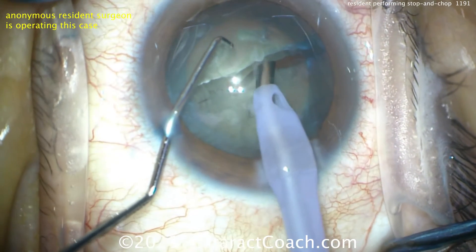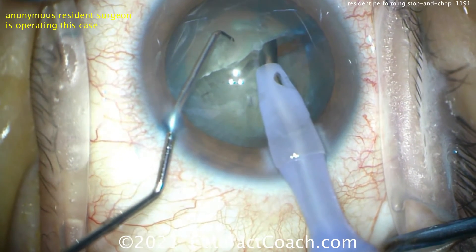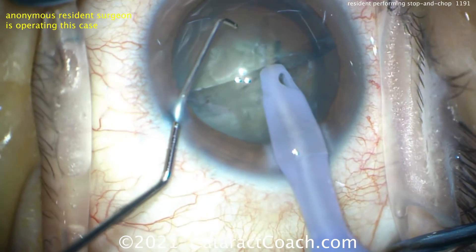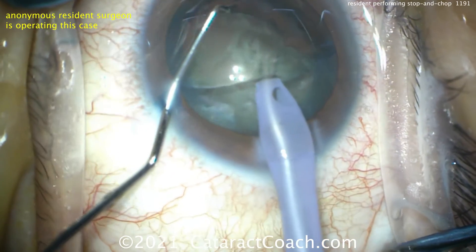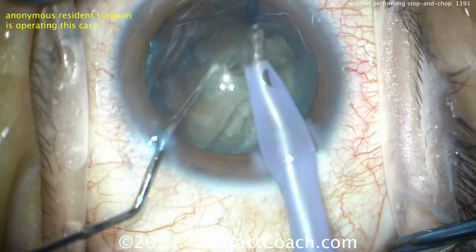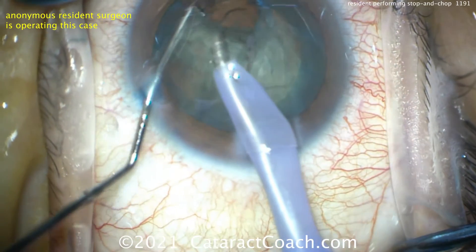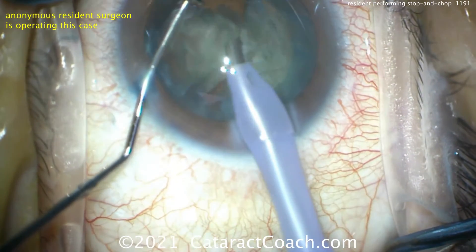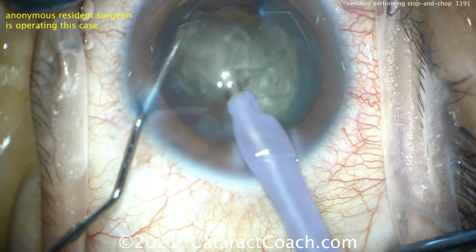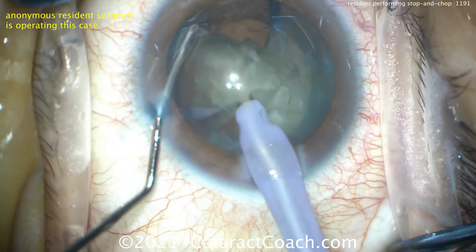Now going to chop mode — higher vacuum, higher flow. Buzzing in until you get a nice high vacuum level. Once that's accomplished, bring the piece out of the bag partially so you can go around the equator. The piece comes up, going around the equator, and chopping that piece off. That's really quite good. The smaller pieces can be removed, and the remainder of the nuclear half can be brought up and chopped into smaller pieces again. At 200 cases, this resident is doing a really good job.